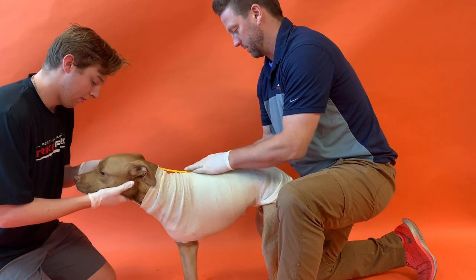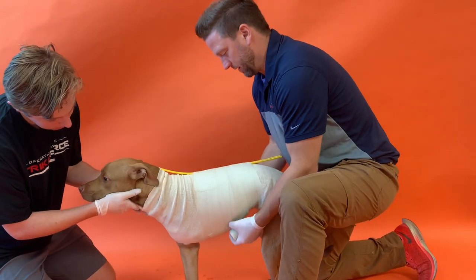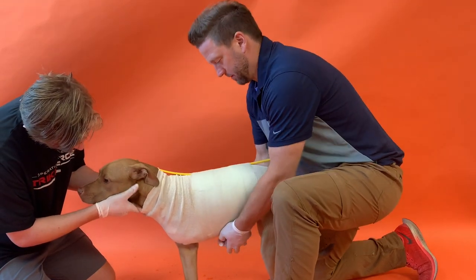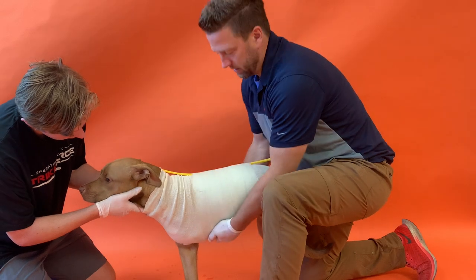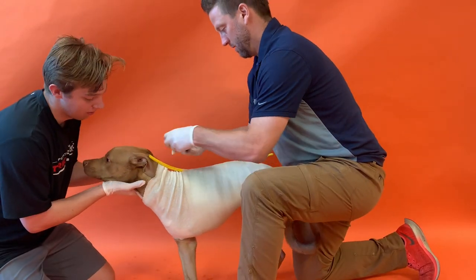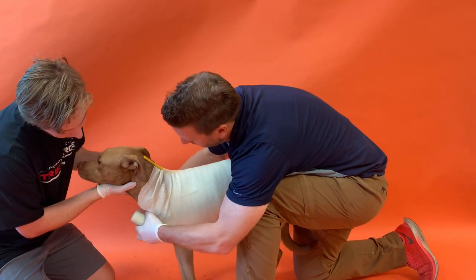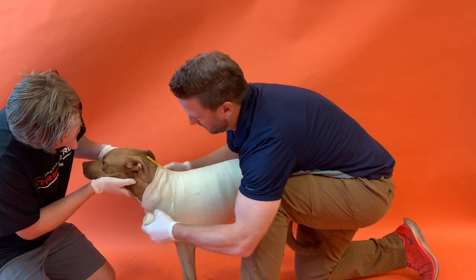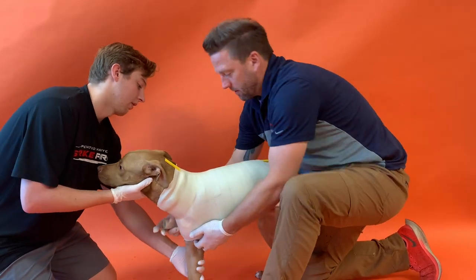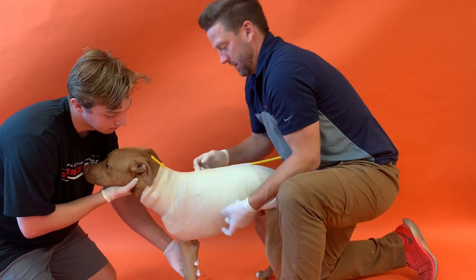Make sure you get past the amputation site and the good leg, and go a couple of rolls around the neck as well. You want this about three to four layers thick — don't be shy with the casting material, it'll hold its shape better if you go a little thicker.